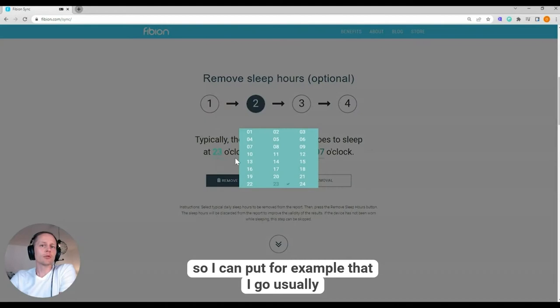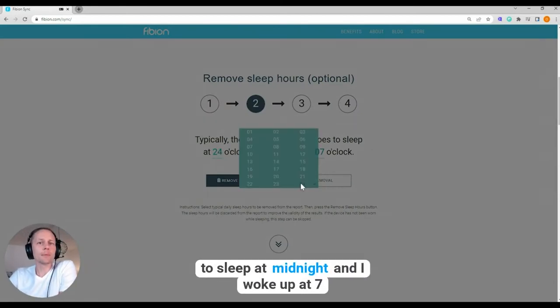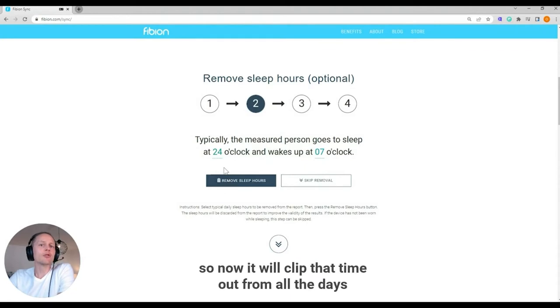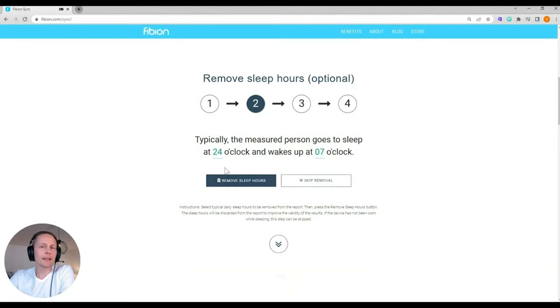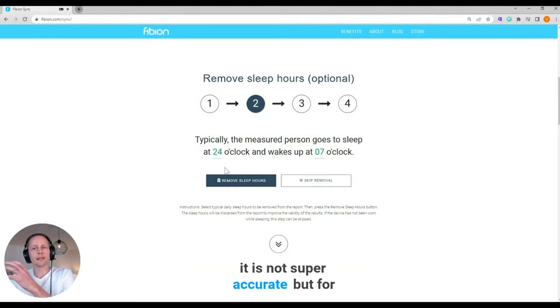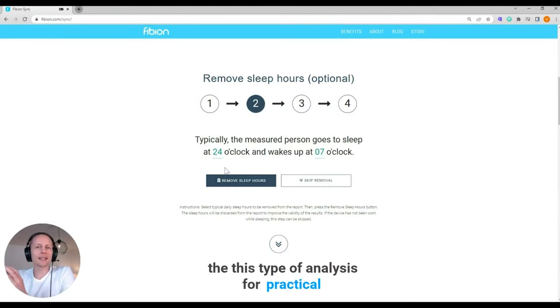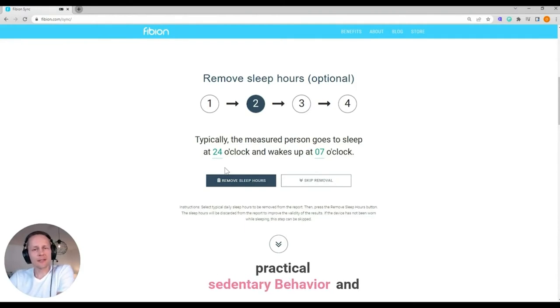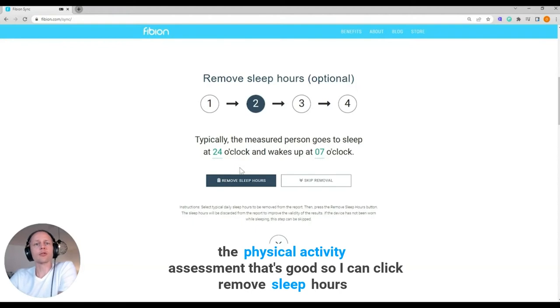So I can put, for example, that I go usually to sleep at midnight and I woke up at 7. So now it will clip that time out from all the days. It is not super accurate, but for this type of analysis, for practical sedentary behavior and physical activity assessment, that's good.